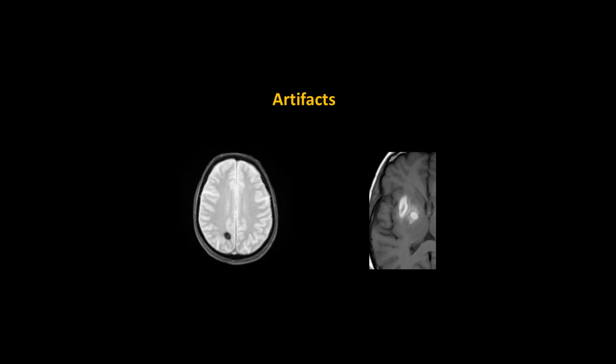And one of them was in one of my friends, and that was a very stressful time for both of us. Turns out she'd been having headaches for about a month, didn't know why. She was in one of my studies anyway. This didn't get picked up by the scan technician. This isn't her image. But she had something that looked like this, a little bit more subtle. But I found it, turned it over to the radiologist, and we got that whole thing taken care of. So it's very important. It's really not just for data quality, but also to make sure that the people are okay.